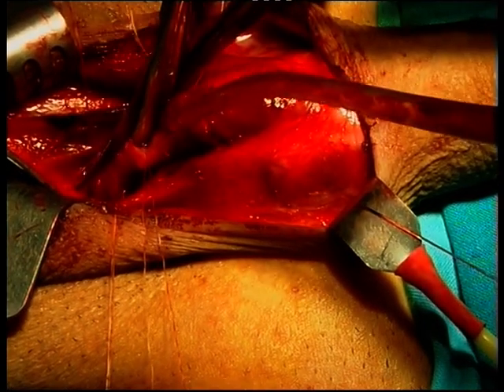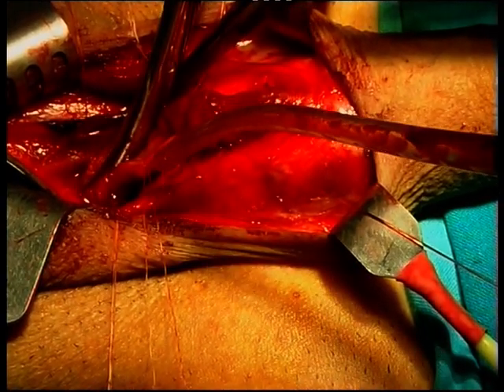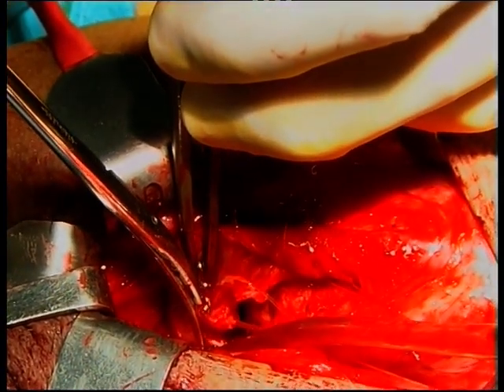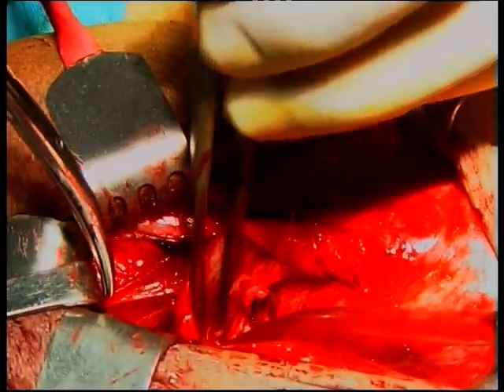Stricturotomy is continued for one to two centimeters into the healthy urethra proximal and distal to the stricture until at least a 24 Charriere caliber is reached.